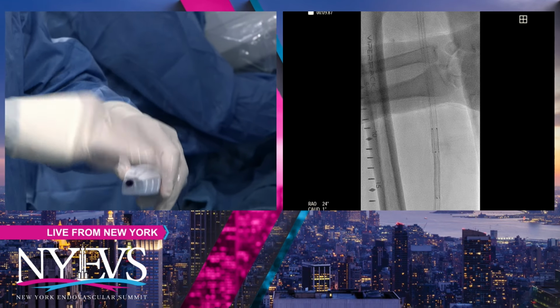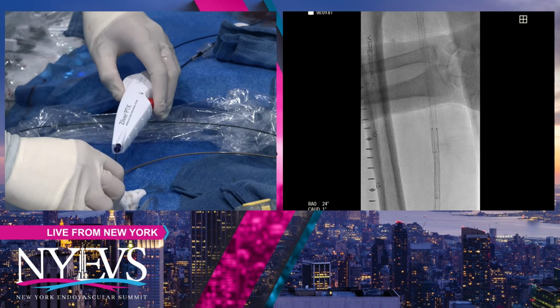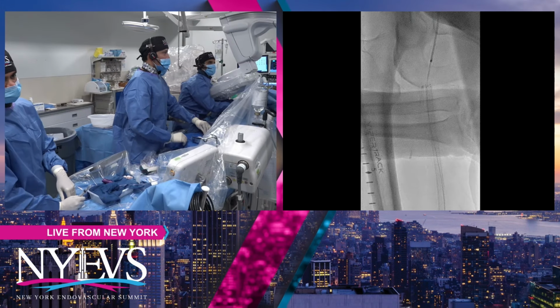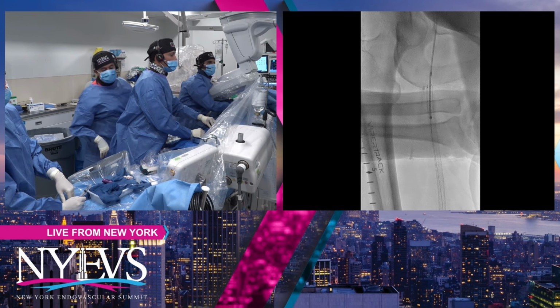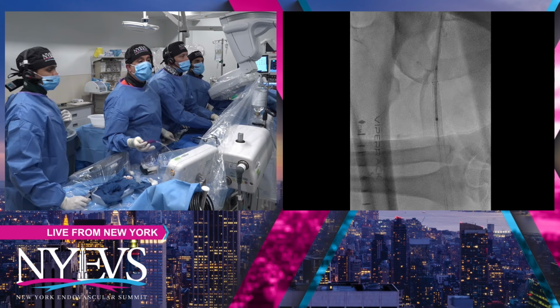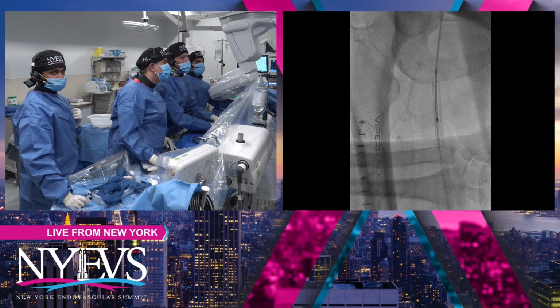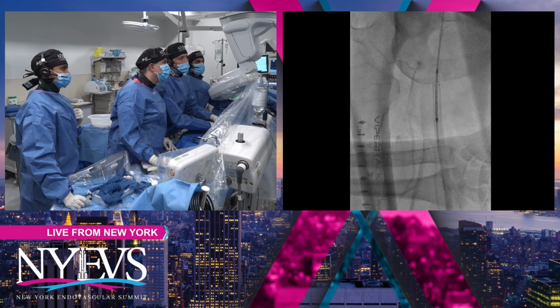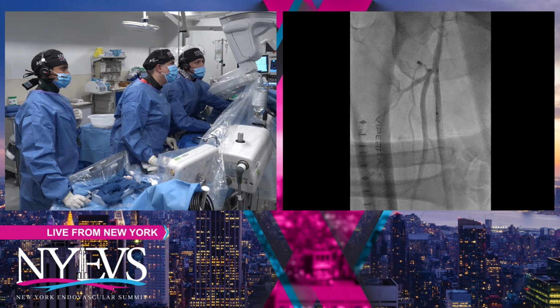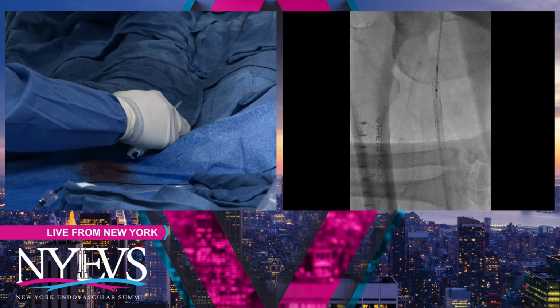So Tom, the other question is, in this kind of lesion, why not just relline it with a Viabahn? The problem is the small diameter of the Supera stent, and if you now add a stent graft, which adds another layer of graft material, you further reduce the lumen. So to stay with the smallest stent diameter profile would be my first choice if I would implant something. No, I think you had only a single vessel runoff, so I would feel uncomfortable putting in a Viabahn stent.